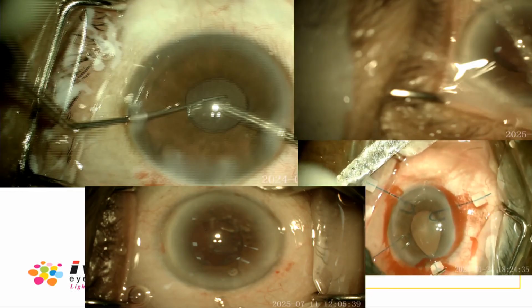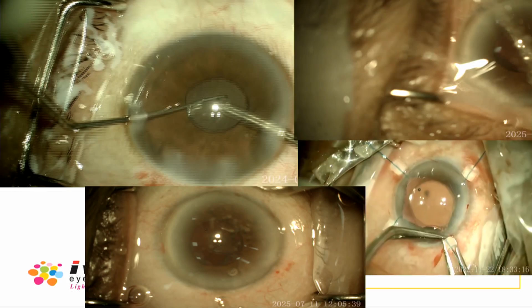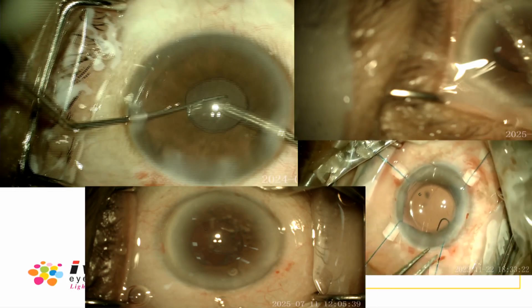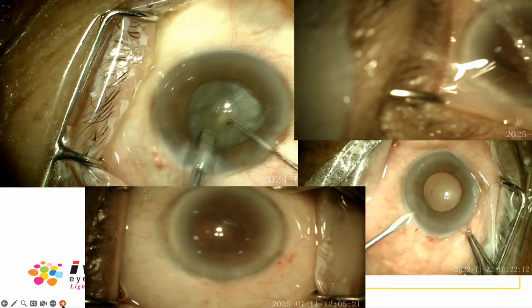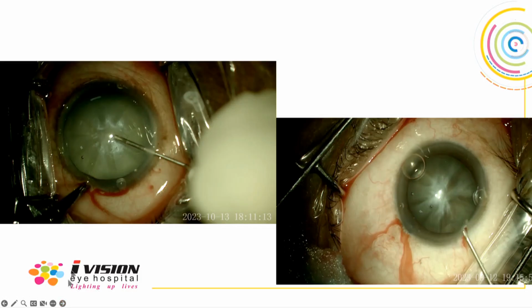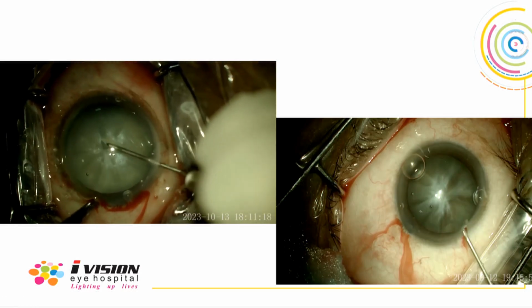surgery. If you have done your rhexis, then you should inject viscoelastic under the rhexis margin and the iris, otherwise you may hook your capsules. And in intumescent cataracts, the toughest part in phaco is your rhexis.